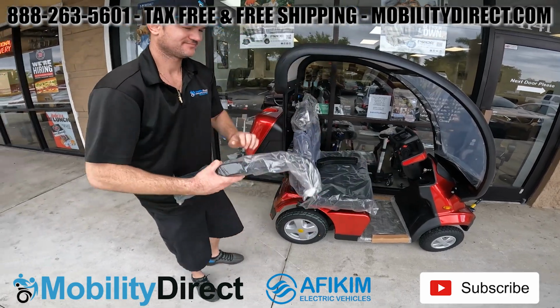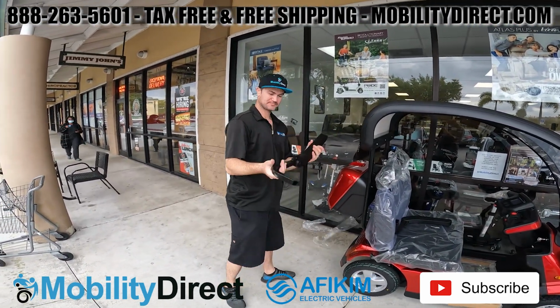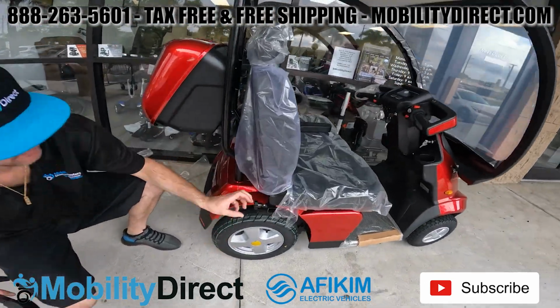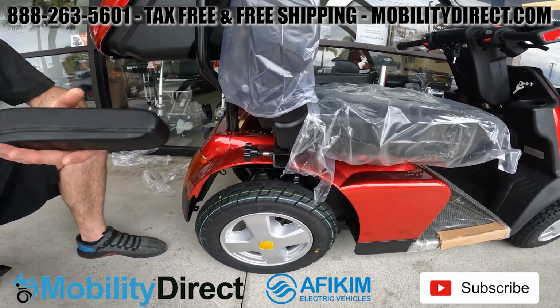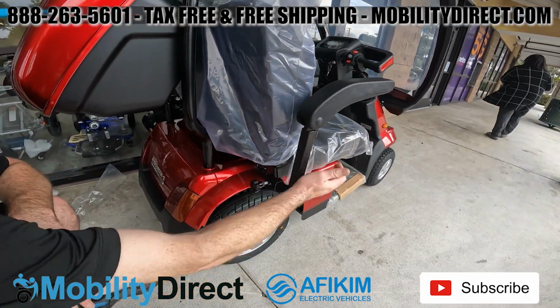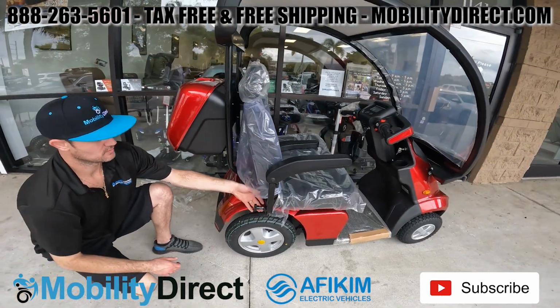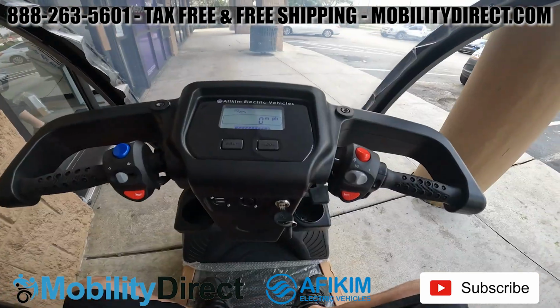Now we're going to show you how to install the armrest, which is very, very easy. They are flip-up armrests, and towards the right and left side of the seat, towards the bottom and the back, you'll see that there are some sleeves with tension adjustment knobs. You'll want to rotate those tension adjustment knobs counterclockwise all the way until the armrest can fit in the sleeve, and then just tighten that adjustment knob when you have the armrest at the right set point.